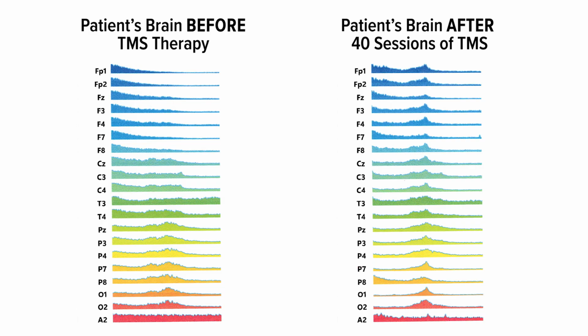What are you seeing with the EEG? So the picture we make is a rainbow pattern. It shows you all 19 brain locations. Something else I wasn't a big fan of was that the typical QEEG was a 35-page report, looking at normals and Z-scores and so forth. To me, what I wanted was one picture. And my patients wanted one picture. Show me my brain. Something that's easy to understand. Easy to understand. So all 19 brain locations are in one view.